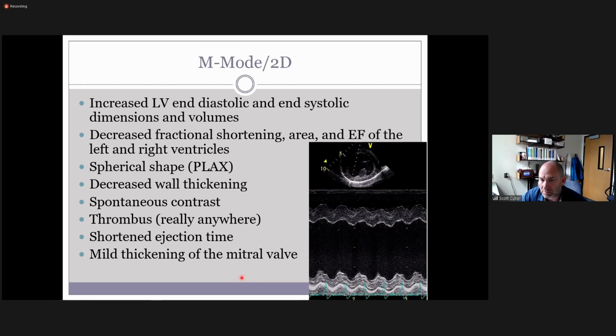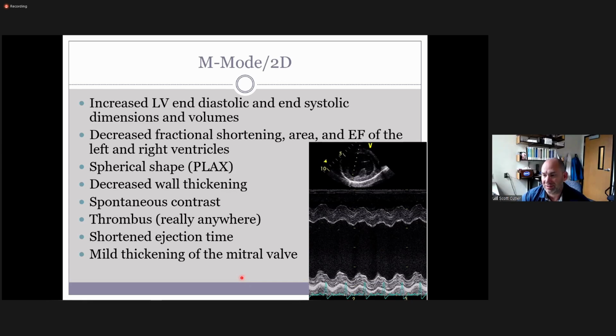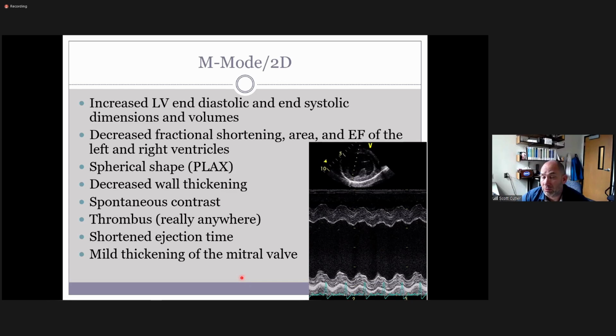Kelsey, go ahead. So I'm sorry, it's not blood clotting, it's just the slower flow, right? Yeah, this is slow flow, but it's suggesting that you've got slow flow, which makes you concerned about blood clots. Because I thought the smoke effect was when you actually had a blood clot. Well, with the new systems, you can actually see it pretty well without clotting, but it does happen just before blood clots start to occur.